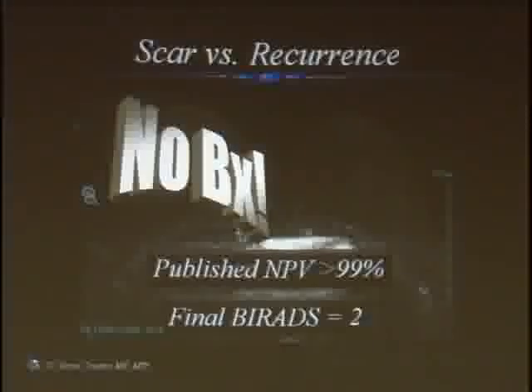You have a patient who's a lumpectomy patient, get a breast MRI if you have any questions about their mammogram. So now we're going to talk about we talked about screening breast MRI, now we're going to talk about staging breast MRI. What's a staging test?